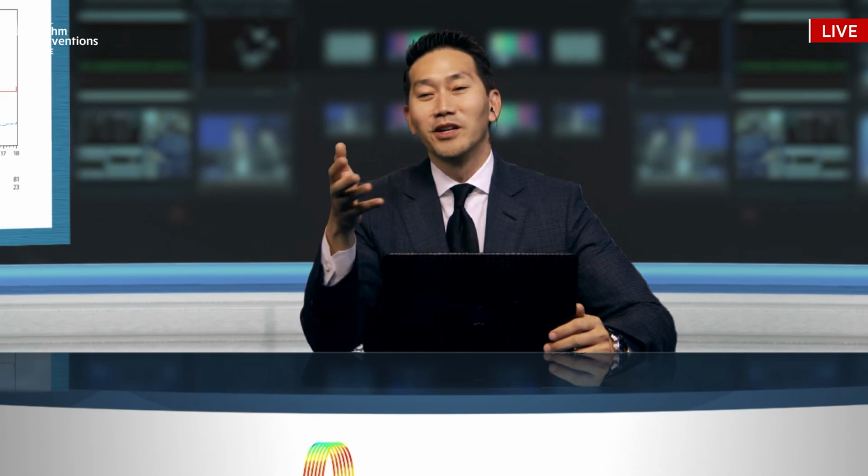Another way of looking at this, because Julian was not offended by my VT analogy, but we know AFib is different from monomorphic scar VT, is that when you terminate VT, it doesn't guarantee you're going to get success and freedom from VT recurrence. And we've looked at that. If you terminate it, it's not like those patients do so much better. That's because any other VT can get you. All it takes is the 6th morphology to come out.